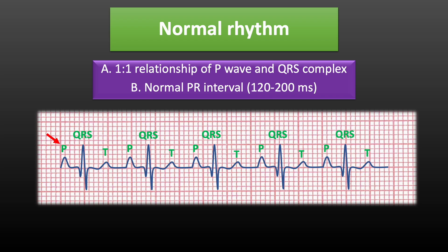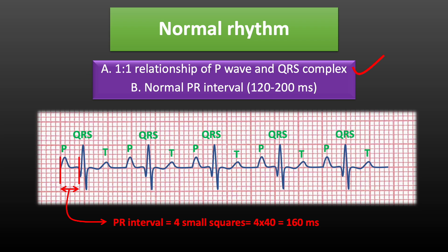In our ECG rhythm, each P wave is followed by a QRS complex. Hence, 1-to-1 relationship of P wave and QRS complex is maintained throughout. Now we calculate PR interval, which is measured from initiation of P wave to the initiation of QRS complex. This is equivalent to 4 small squares. Each small square on ECG paper is equal to 40 ms. Hence PR interval in this case is 160 ms, which is within normal limits. So this ECG doesn't have any AV block and shows normal rhythm.